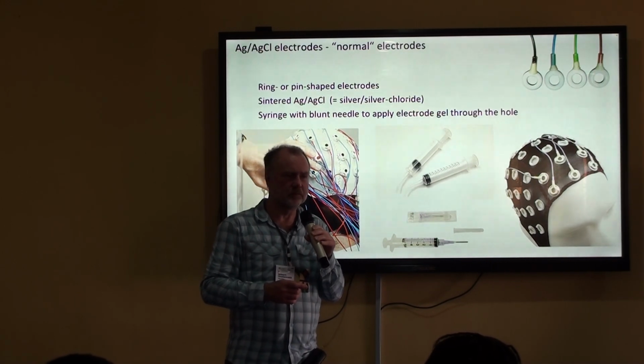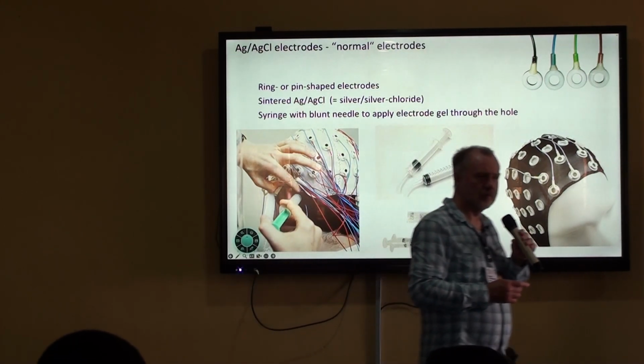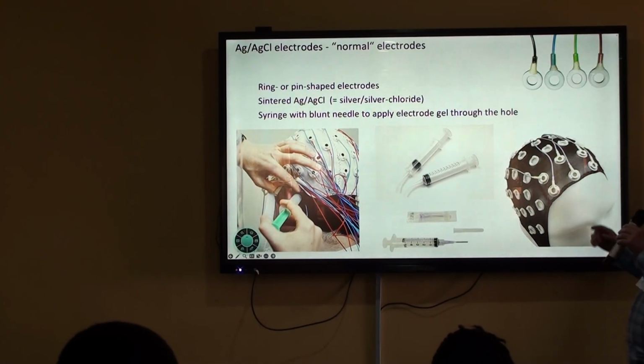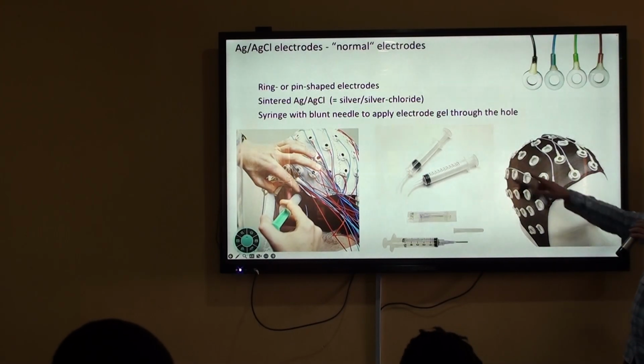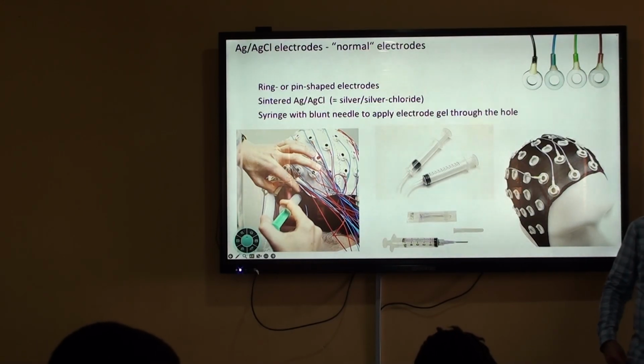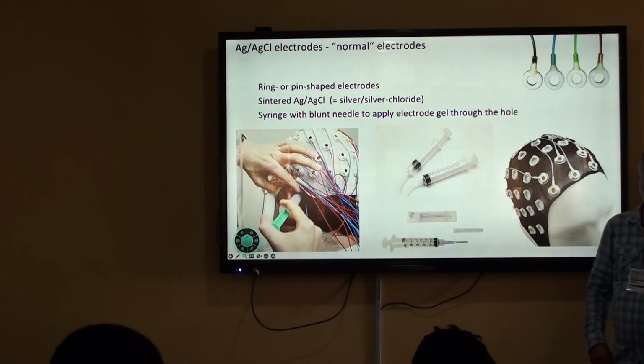Okay, you're talking about feeling here. Sorry. With gel. Yeah, so this is with the gel, yes. So you don't know the distance from the ear to the scalp? Is it a particular distance?